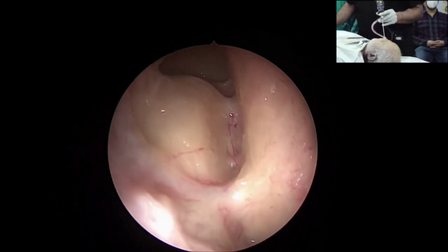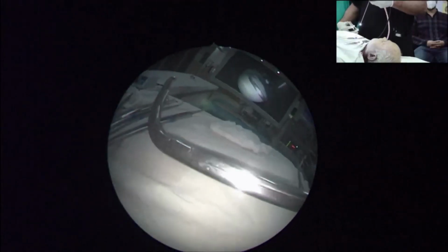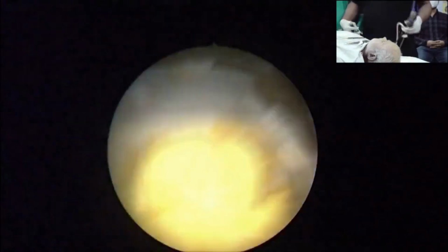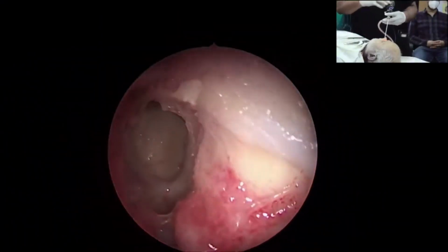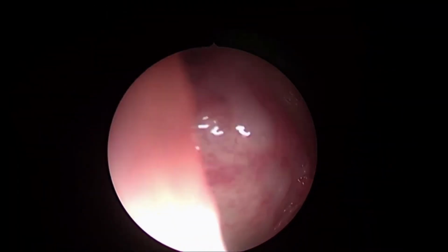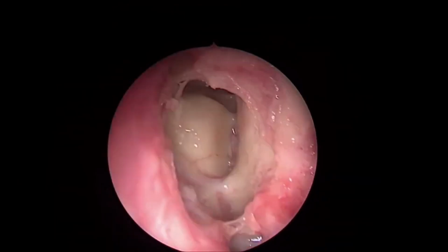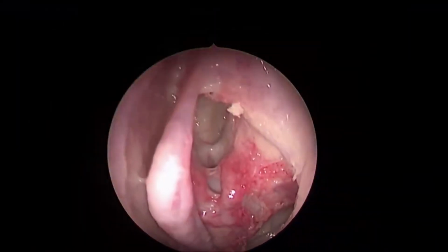Can you show us this instrument? Yes, this has 9 articulations. There are others available with even 16 articulations. You can see this is from Karl Storz, the articulated punch, and it's an amazing tool. Our frontal sinus tools are altogether different. They are long angled instruments, and there are more than 30 instruments we use of different sizes at different stages into the frontal sinus for the required reason. Okay? Paramita, do we go ahead? Any questions?